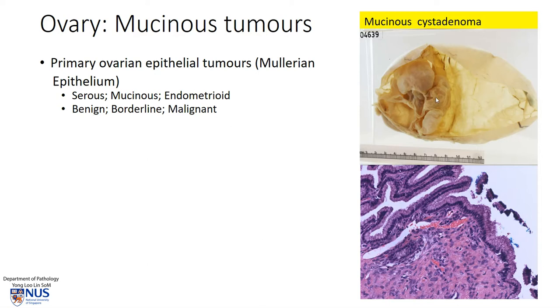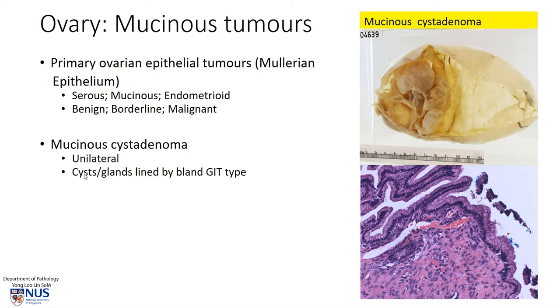This is an example of a benign mucinous cystadenoma. These are usually unilateral, and what we see are cysts that are lined by bland gastrointestinal type mucinous epithelium with quite abundant cytoplasmic mucin. And here you can see the cyst lining — the nuclei are all very basal, and it's a single layer of mucinous epithelium.